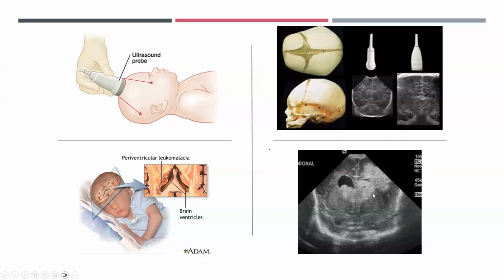Now, if you have an IVH, you have a lot of blood, and this blood will cause a lot of scattering. But more importantly, blood has a uniform density. So not only will sound waves scatter, you'll get the bright reflection that you can see. These sound waves will travel with a uniform intensity through. So what you then see is one large bright area because of the uniform nature and propagation velocity of the sound waves, which then reflect back off the distal margin. Again, the reflection gives you a bright appearance, and that's why an IVH appears bright.